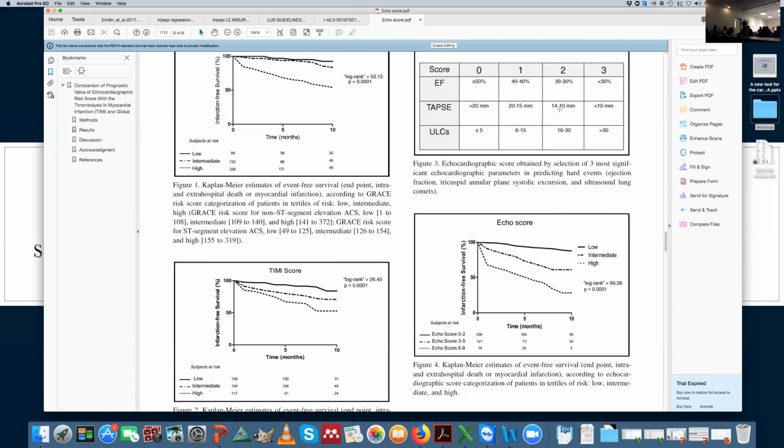Okay, Luna, I agree with you, but this is a sort of misunderstanding, because this randomization is useful to assess the outcome of our patients. And I agree that there are no outcome studies on lung ultrasound, and this is the next step. But when they say that the validity of lung ultrasound has not been proven because there are no randomized studies, this is not true. This is the point.